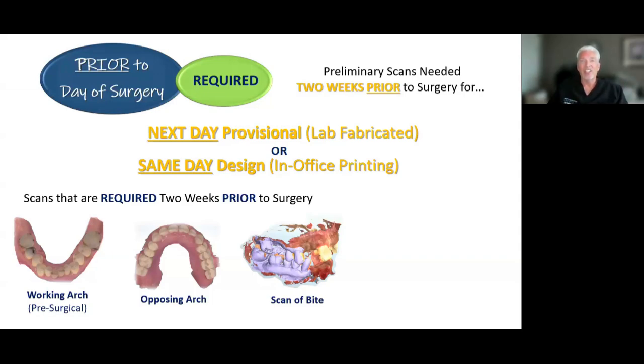Once you have your iOS scans and your photogrammetry scans on the day of surgery, you upload those to them that same day, and they start putting things together. They either do a design and send it to you in about a 2 hour time period, and you can print that in your office if you have your own in-office printer, or they can print it at the lab, stain and glaze it, and get it out to FedEx or UPS that day, and the next morning your restorative doctor, or whoever is delivering it to the patient, delivers the provisional.